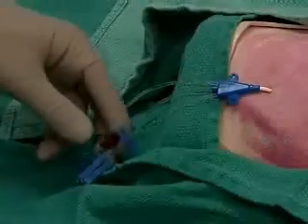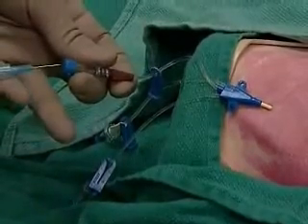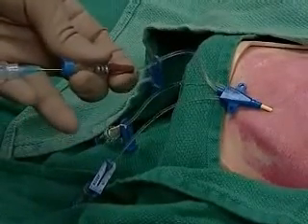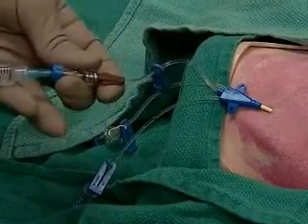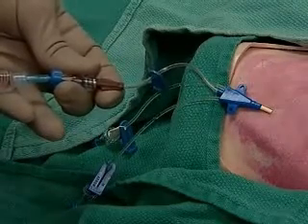Now, an important check. Put a syringe containing saline in the hub and make sure you can both withdraw and infuse fluids. You'll check all hubs in this way before suturing and applying a sterile dressing.